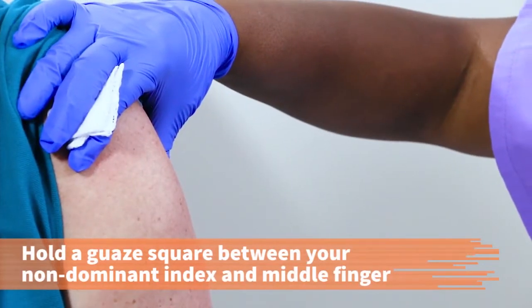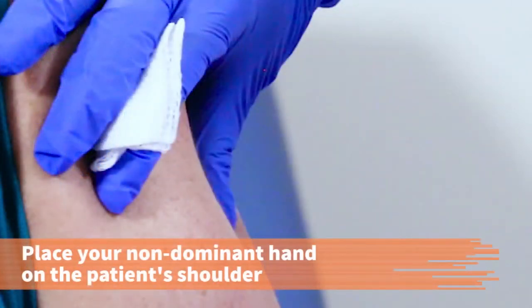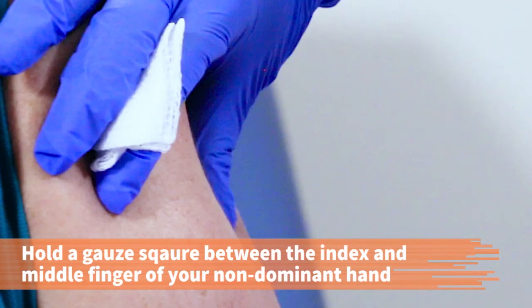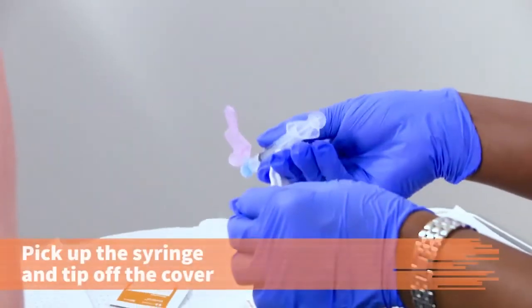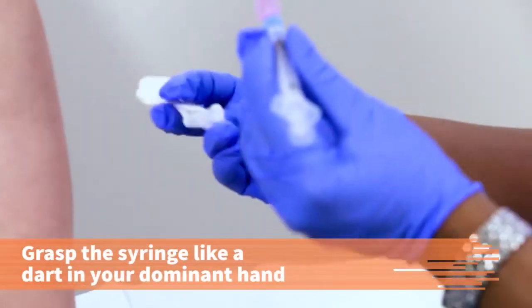Let the site dry. Place a gauze square between your index and middle finger of your non-dominant hand. To compress fat and stabilize the muscle, place your non-dominant hand on the patient's shoulder. With that hand, use your index finger and thumb to pinch up at the cleansed area. And with the thumb and first 2 fingers, spread the skin tightly and grasp the muscle deeply on each side. Hold the site. Pick up the syringe and tip it to remove the cover. Hold the syringe like a dart in your dominant hand.